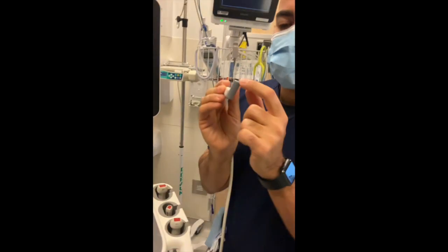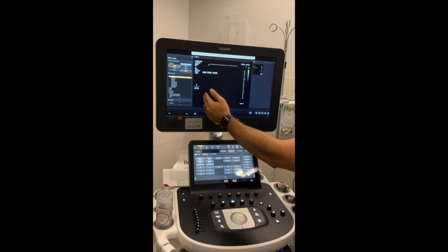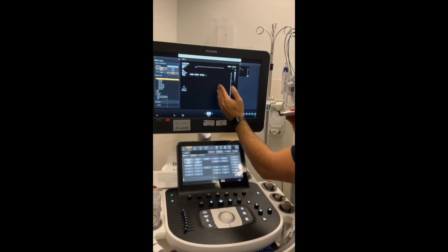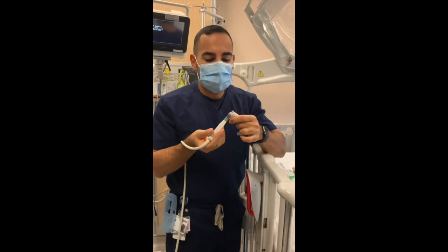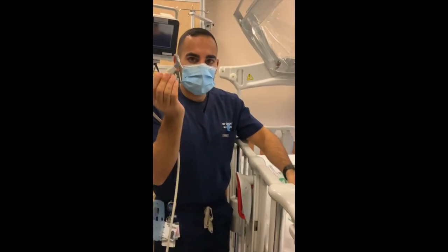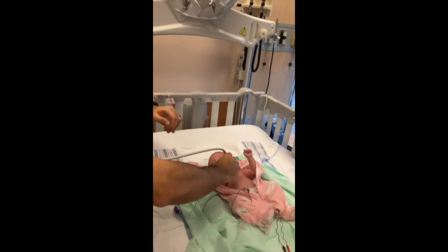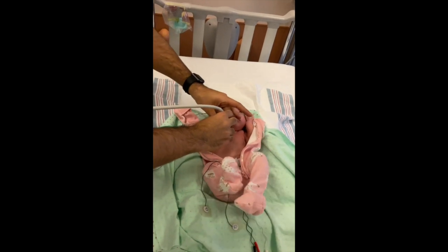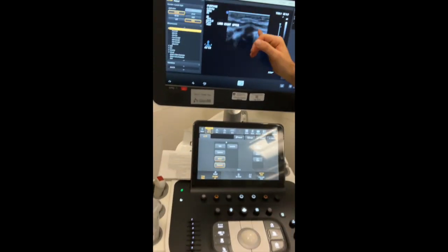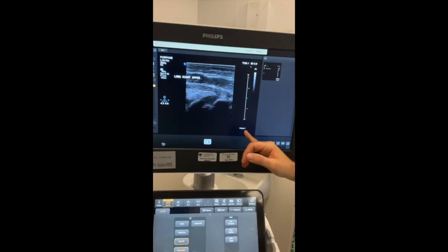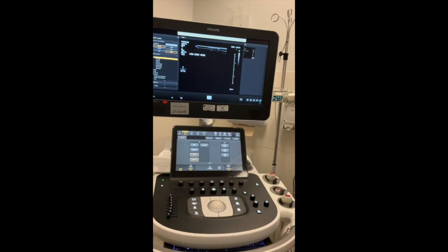This means the cursor is pointing here, and on my screen the cursor is on the left side — indicating that whatever is here is cranial towards the head and whatever is on the right side is caudal, towards the feet. I have individual packs of gel, which are clean gel — we use one per patient at our institution. Once I have the gel, I'm able to start the recording. I put the probe in the first aspect of the lungs, and the idea is to have five seconds. I make sure I can see my ribs and have at least three centimeters of depth. I want at least five seconds for the loop.